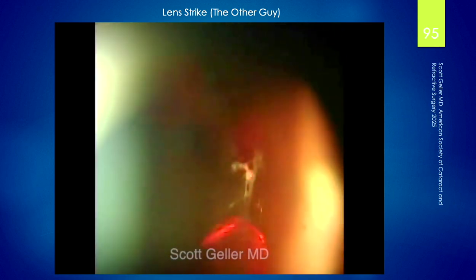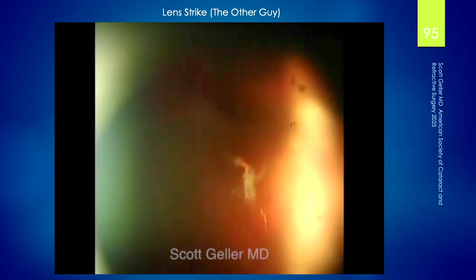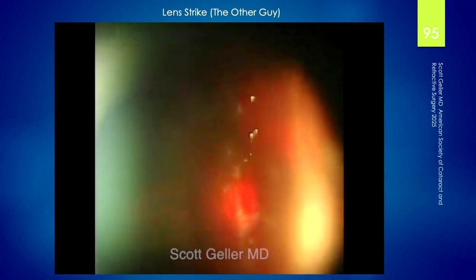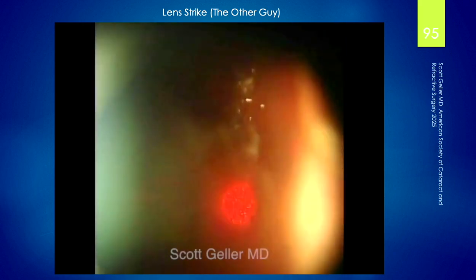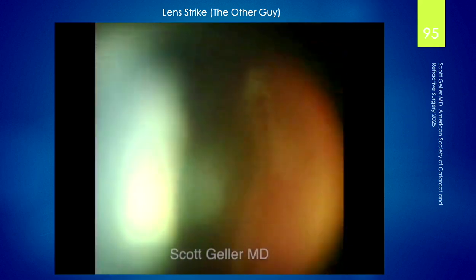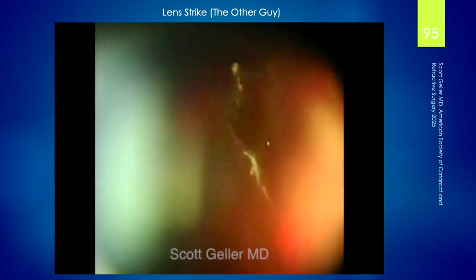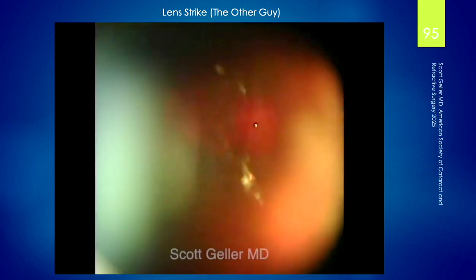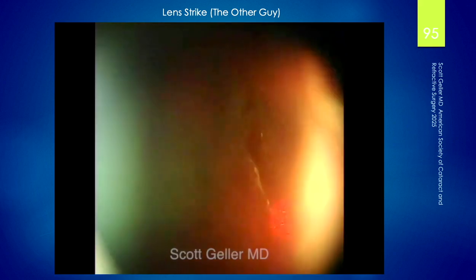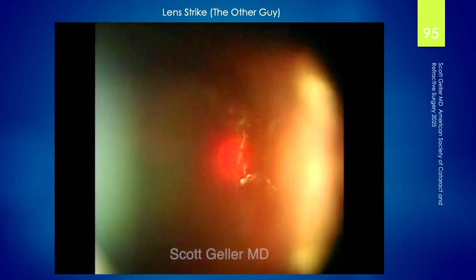The reason he came to me was after the doctor was a little nervous and said he wanted to hold off putting more laser in. His other eye had a macular central histoscar. So this was essentially a one-eyed patient. One-eyed patients can be extremely disturbed by floaters, especially if the opacity is in the visual axis. There we go. Anyway, I got it. Let's go to the next one.